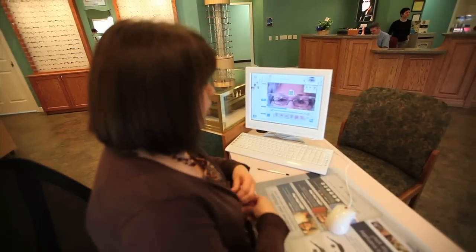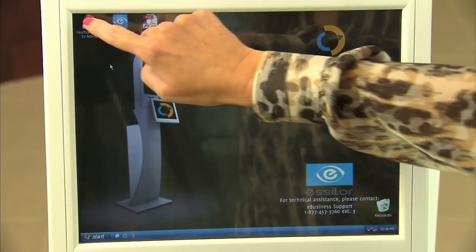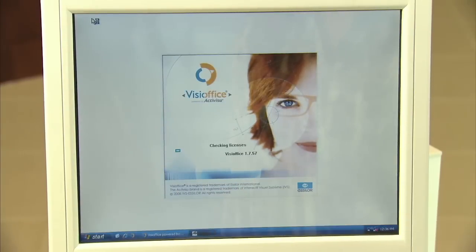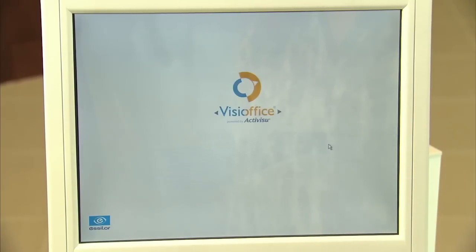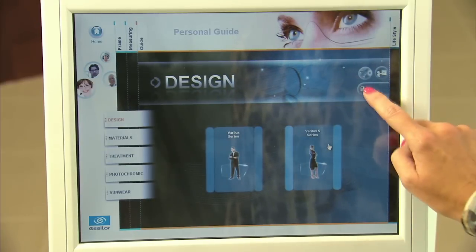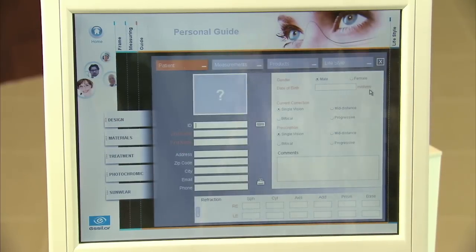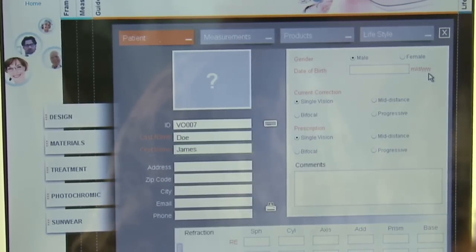ECPs can guide the patient through any number of the VisiOffice system's functions in any order they wish. You begin by choosing a patient category: child, adult single vision, or adult presbyo. After choosing the patient category, the system begins with the guide section. Make sure to open a new patient file and input the patient's prescription. This file will capture and store all of the patient's measurement data from the other sections.